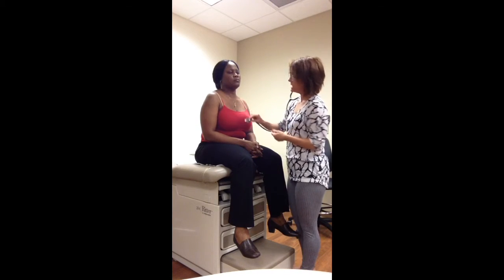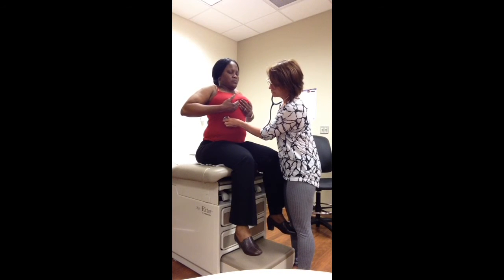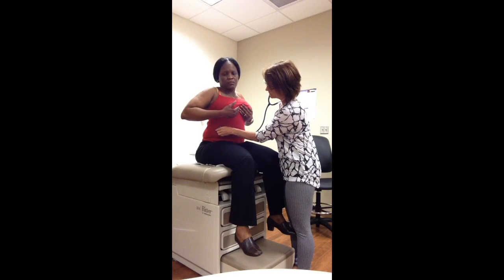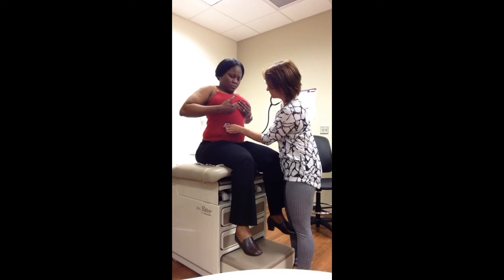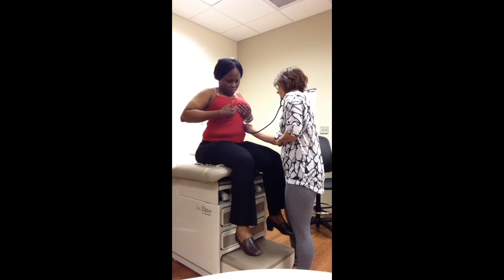And then this is where you can ask her if she could just lift the breast tissue up out of the way, and you can listen to the middle lobe and the lower lobe. And then on the left side, oh, there, I heard some lung sounds.